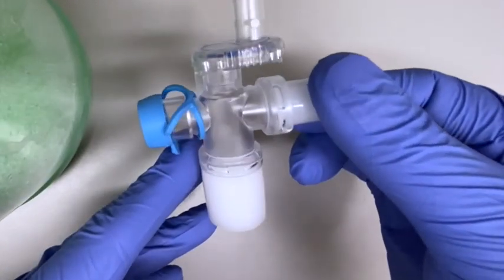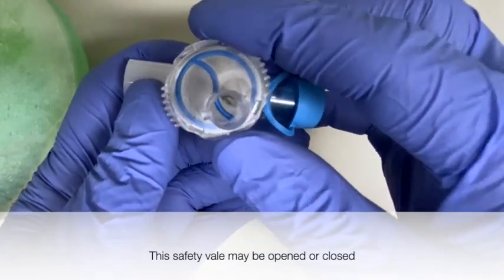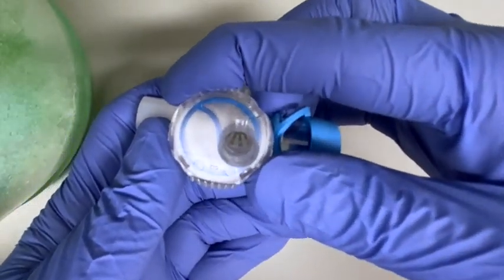The opposite end attaches to the closed and open valve system. Here you can see where each of the tubes attach. The valve can be placed in the closed or the open position as is shown here.